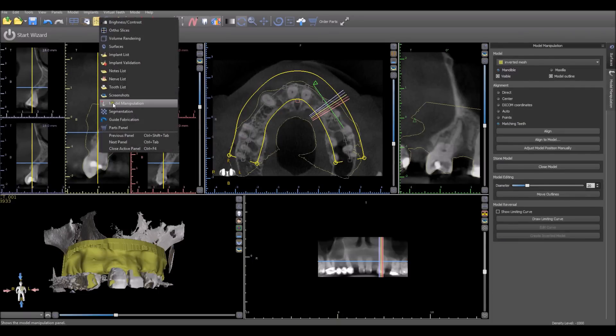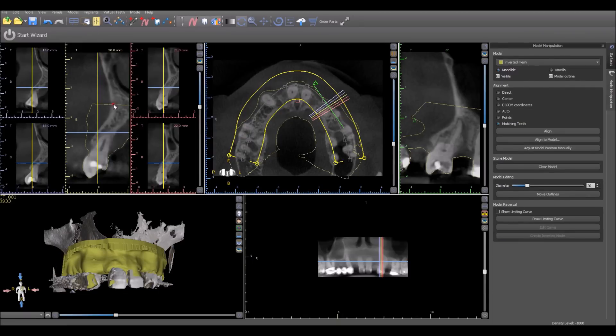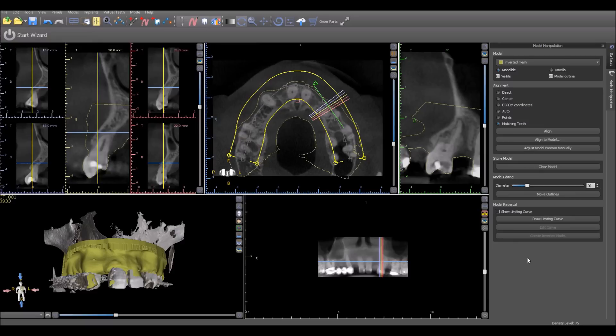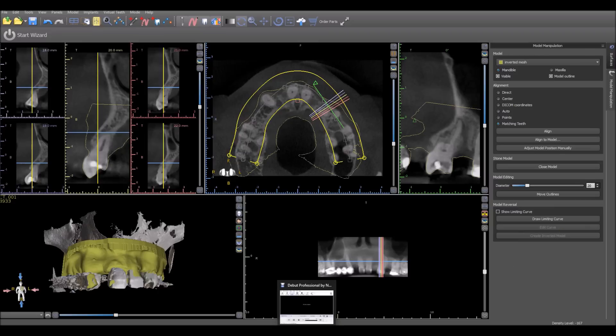The model manipulation panel also gives us access to the impression inversion functionality if we didn't conclude the entire process previously, or if we wanted to re-invert or do other manipulations with the model.